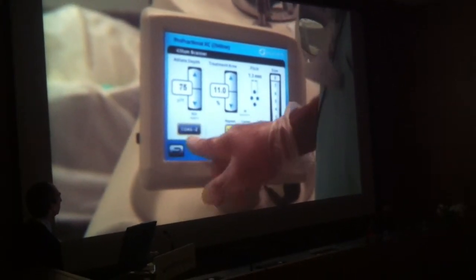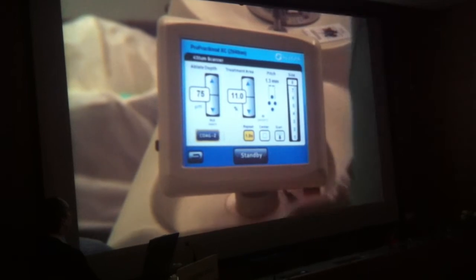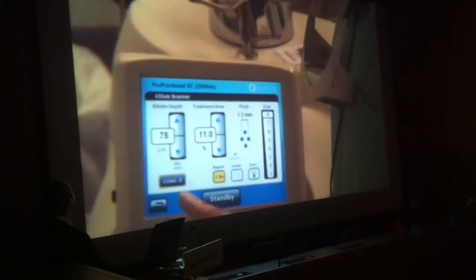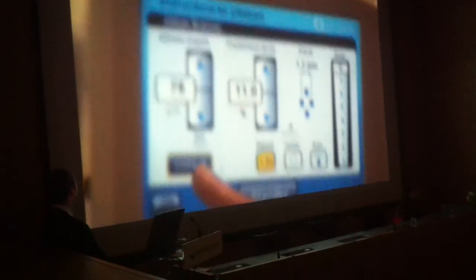So coagulation is important both for skin tightening to deliver deep heat with relatively shallow ablation, and yet, can you focus on that, please? No, focus. Focus. Okay, thank you. If it can be a bit neater. And so this coagulation here, I don't know if you can see it. It looks blurred on my end.